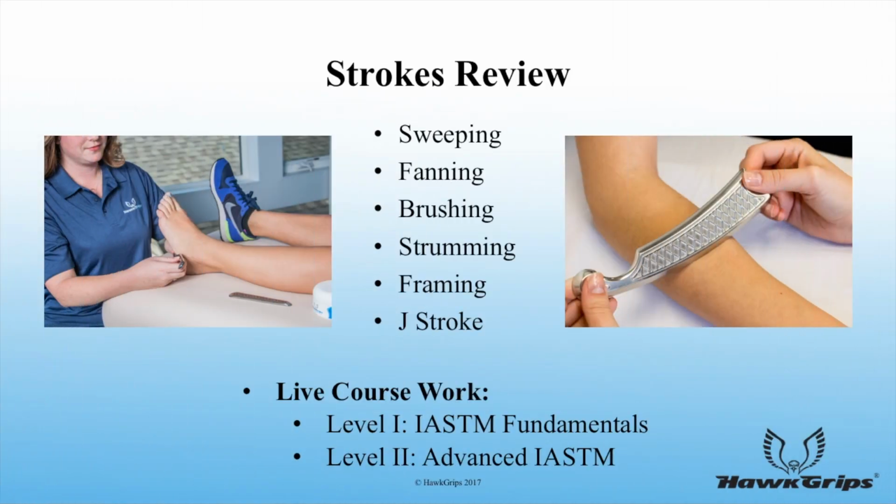To review, the primary strokes are the sweeping, fanning, brushing, strumming, framing, and J-strokes. These are the basic key strokes utilized for all IASTM treatments. There are 2 live courses as provided by the HawkGrips educational team, each course totaling 8 contact hours.